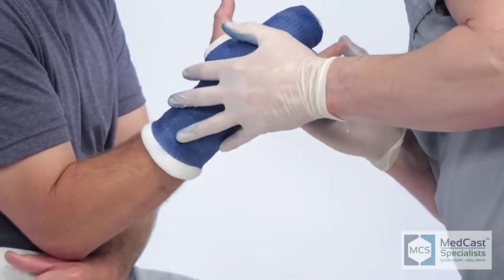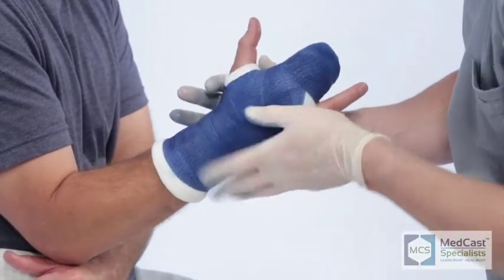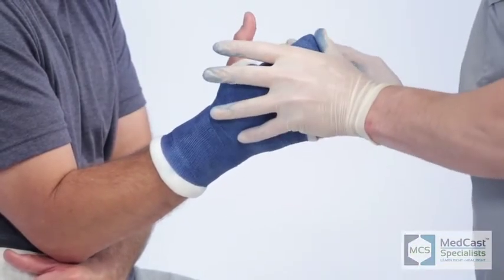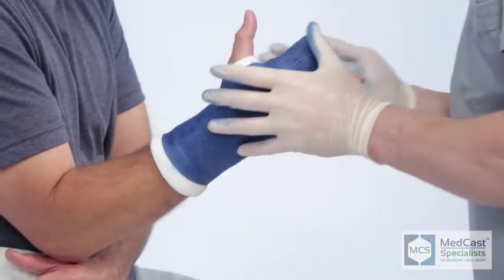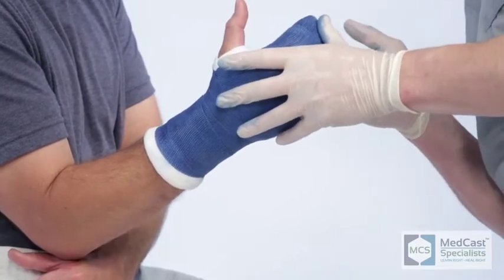We may emphasize the fiberglass strip, the reinforcing strip that we use. If you do not have access to that, you can usually use another roll of fiberglass and roll it out, maybe 3 to 4, maybe even 5 layers thick, and then cut it off and measure it to whatever you need and trim it, and that will suffice for the reinforcing strip also.